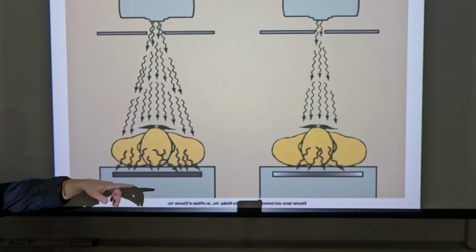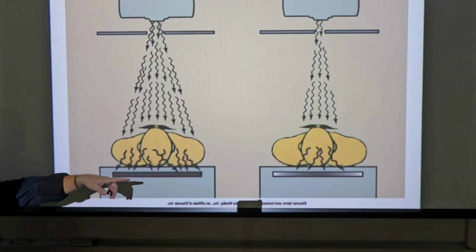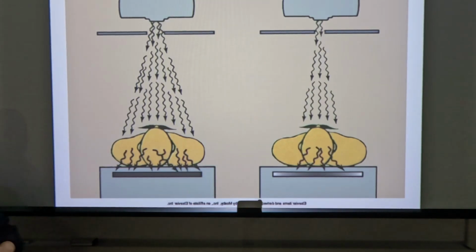So there are times for this, right? If your patient comes in and you ask them, where are you hurting? And they're pointing to here. My back hurts. Well, where is it? It's kind of on the back side of this right here, right? When you T-spine, your collimated field should be smaller than that. So should you open up your collimation?